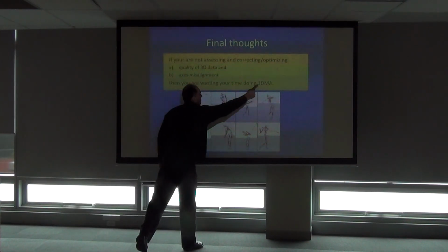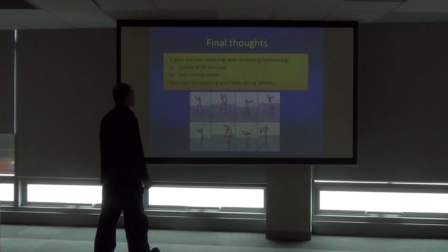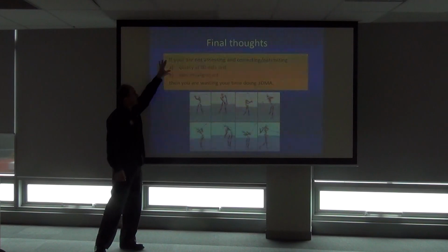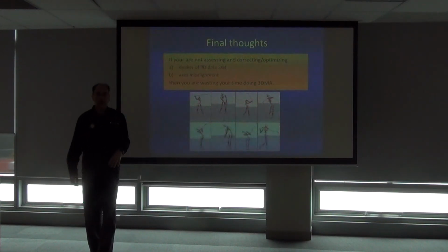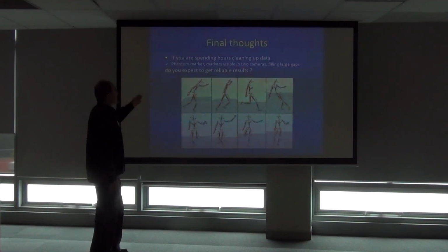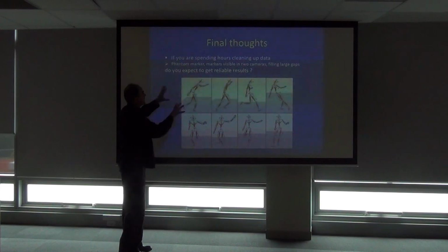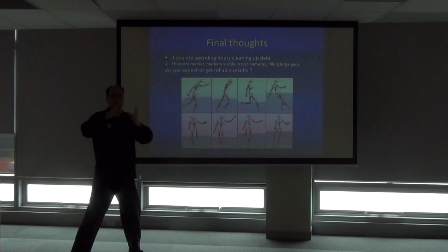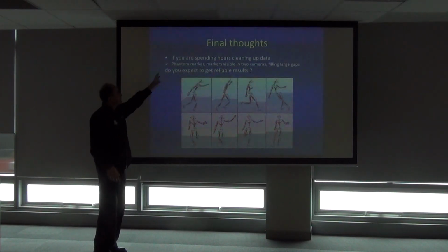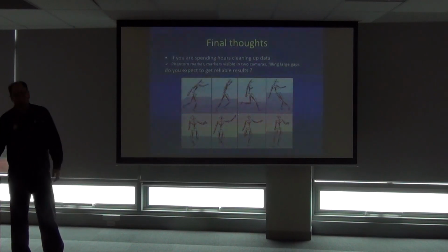Here we're talking 3D. 3D, we're interested in non-sagittal plane rotations. So if you're interested in non-sagittal plane rotations and you're not assessing, correcting, optimizing these, then you're wasting your time. If you're spending hours cleaning up data, getting rid of phantom markers that are floating around, you've got markers that a lot of your markers are only visible in 2 cameras, you're filling large gaps, then do you expect to get reliable results? No.